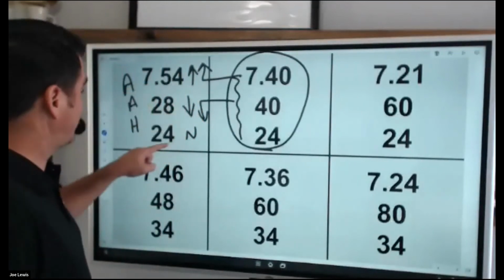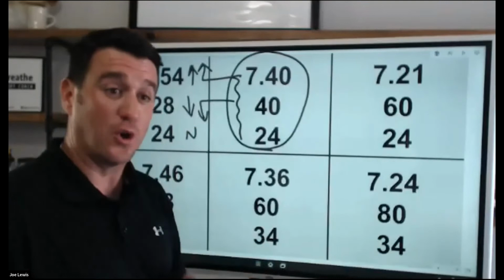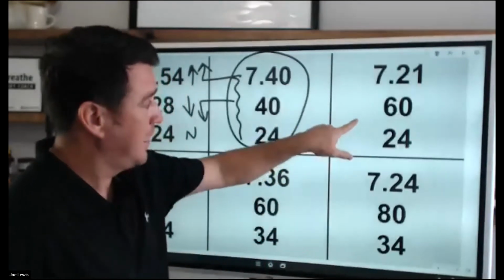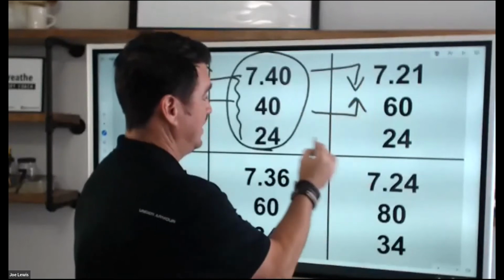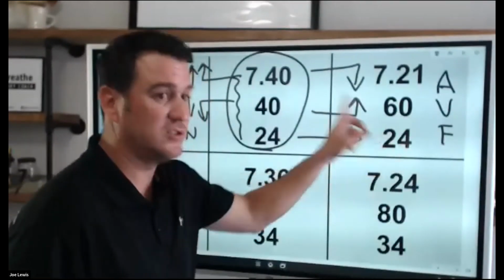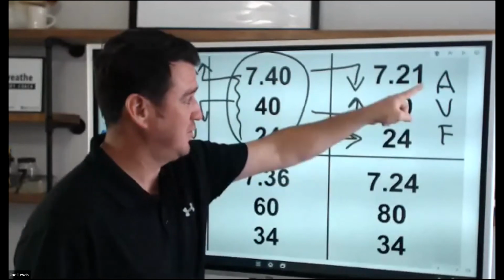Now, when we look at this from our standard ABG interpretations, again, we call this uncompensated respiratory alkalosis. The word respiratory in there tells you it's a problem with the CO2. Perfect, got it. Let's slide over here. CO2 goes up, pH goes down. Bicarb stays the same. This is acute ventilatory failure superimposed on normal, right? We don't have to say that, but just to make a point here. This is their normal. So we just say acute ventilatory failure.